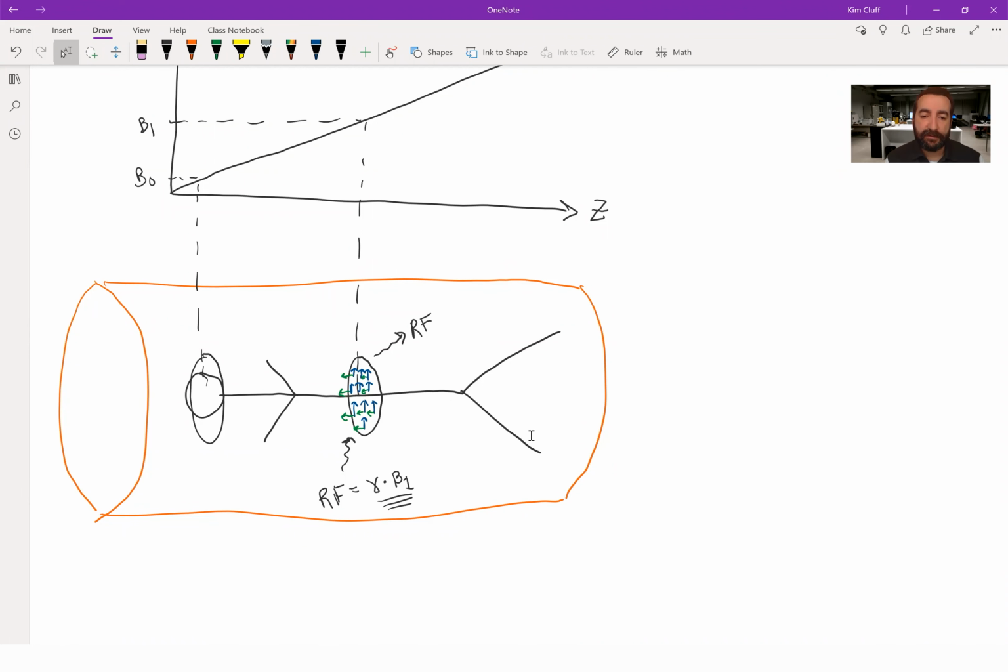Well, as it turns out, in MRI imaging, depending on how the hydrogen atom is attached to water, soft tissue, muscle, brain, whatever, they will all have different T1 and T2 parameters, which give rise to contrast.